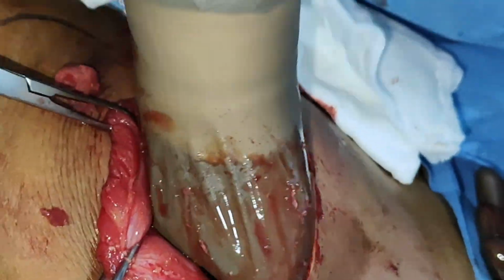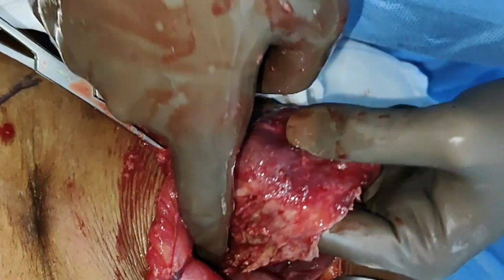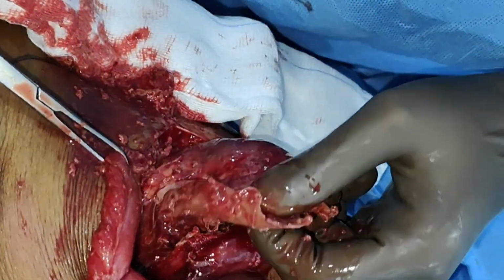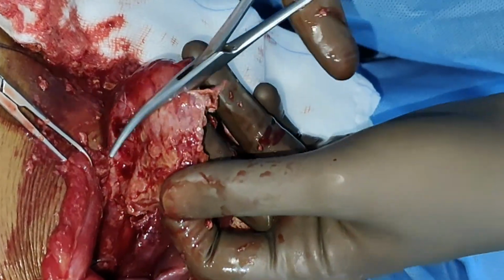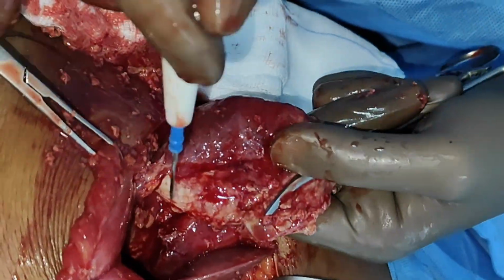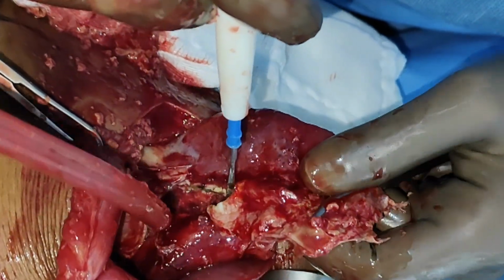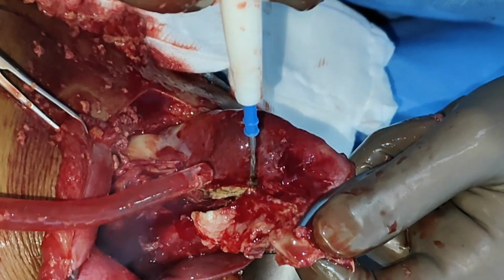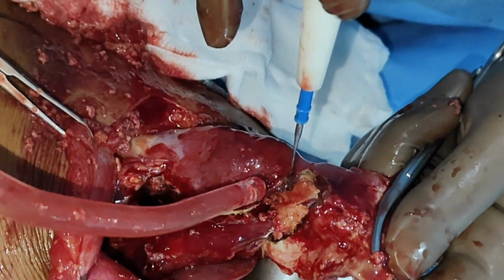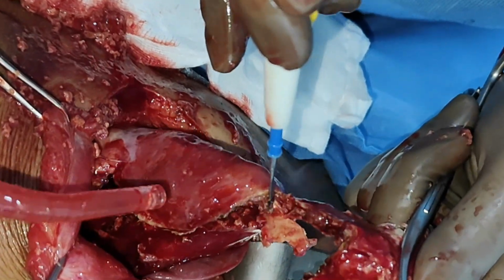Once that was done, the deroofing of the cyst was started. So we started palpating the cyst wall. The edge of the cyst wall to the liver was cut using a cautery. So here this is the superior aspect of the cyst wall which was taken care of. As you can see, we have just held it in our artery forceps and exactly at the edge of liver and cyst, we have started cutting off and doing a wide deroofing of the cyst.